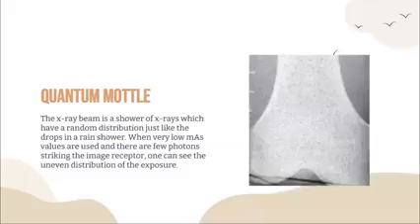Dili siya maglihok-lihok such pareha sa inyong electronic noise. The X-ray beam is a shower of X-rays which have a random distribution, just like the drops in a rain shower. So dili man gyud ang X-rays ninyo, dili man siya determined. It's a random distribution sa padulong sa image receptor. Okay? So dili siya determined na okay kani siya na X-ray padulong dire, kani siya na X-ray padulong dire.